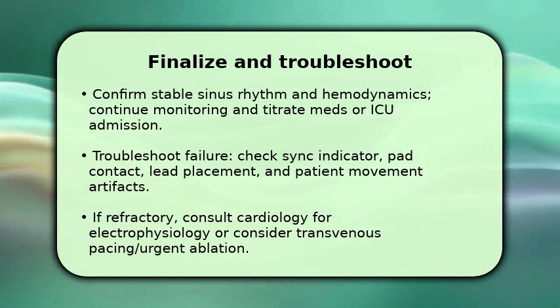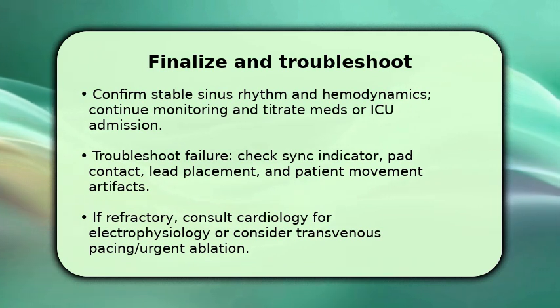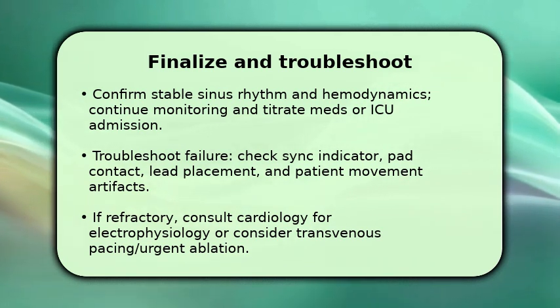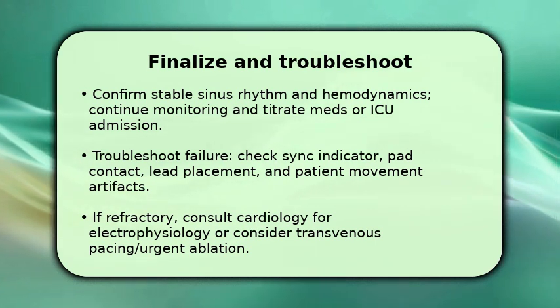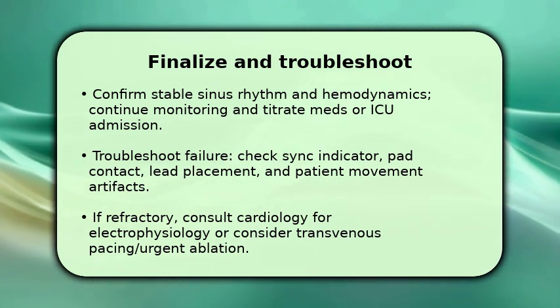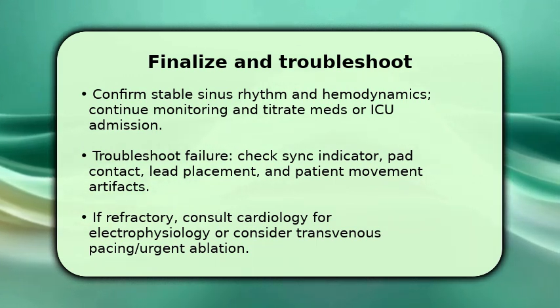Verify the defibrillator's sync marker is detecting the QRS, ensure pads have good contact and correct placement, and eliminate motion or electrical noise. If problems persist, escalate care. Call cardiology for urgent electrophysiology input, prepare transvenous pacing, and discuss definitive therapies like.